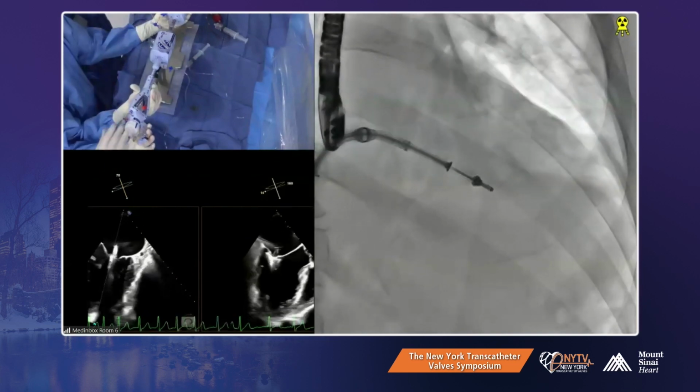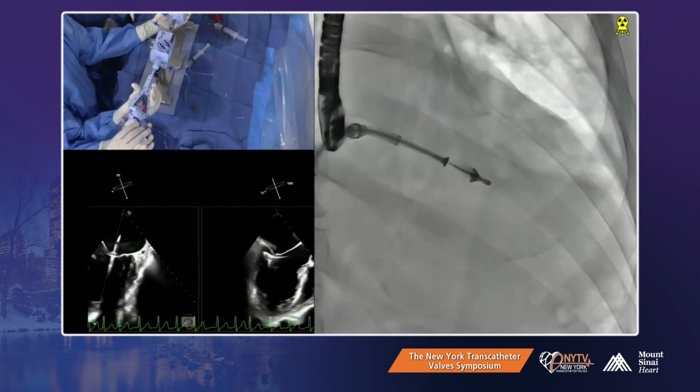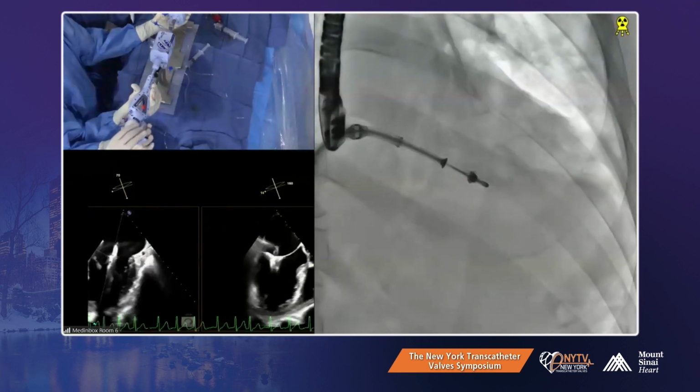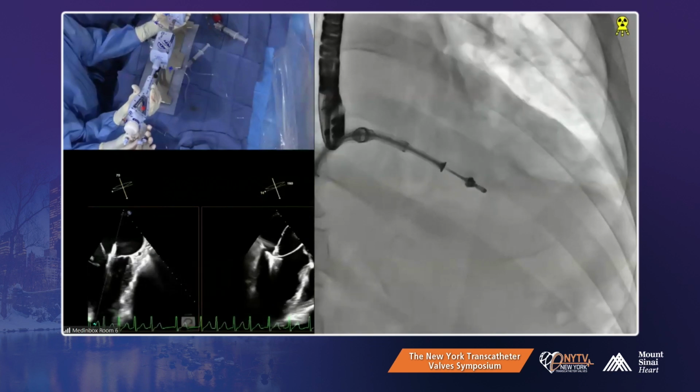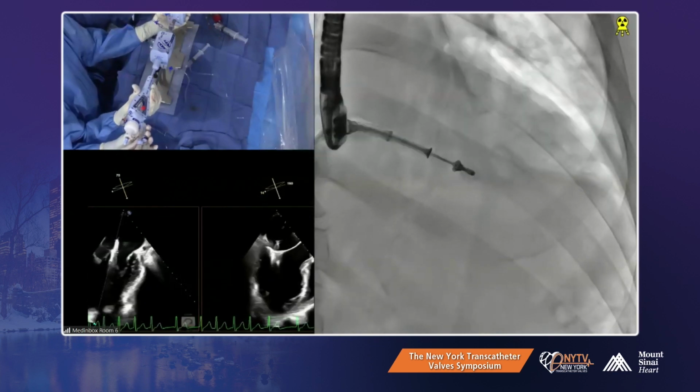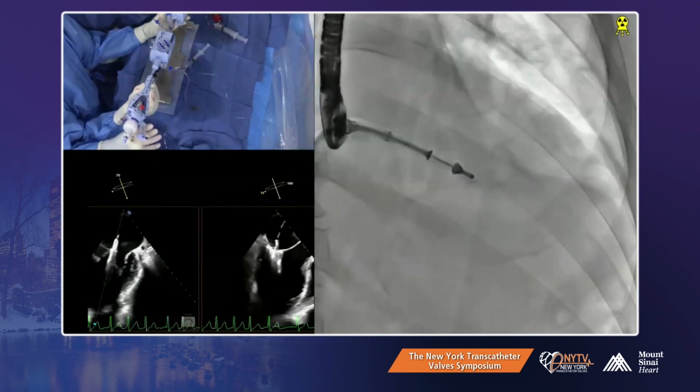Close the clip, close a little bit. Take anterior. Close a little bit more. Anterior grip is down. Posterior. Okay, beautiful. Go. Posterior now, down. Oh, great. Posterior is down.